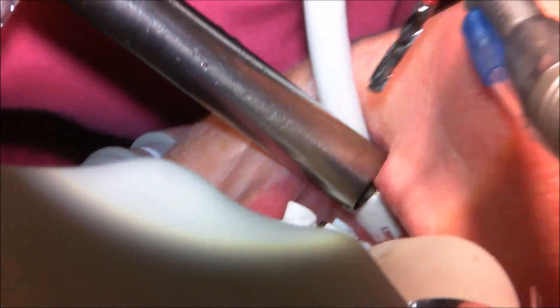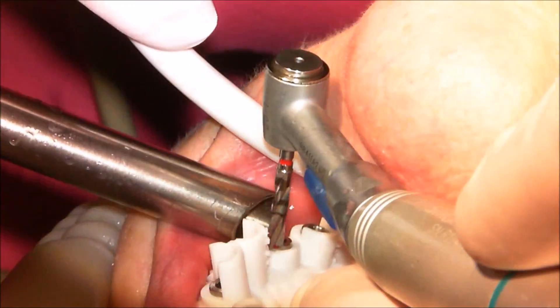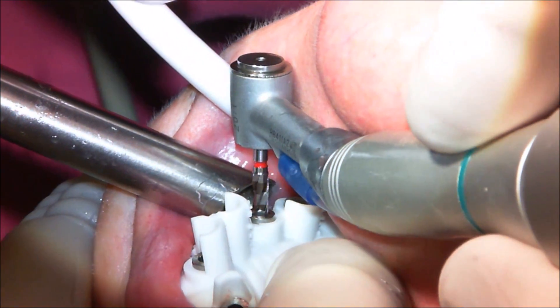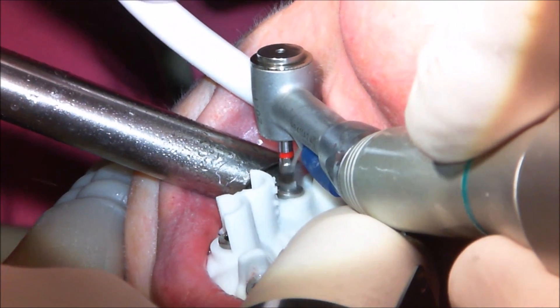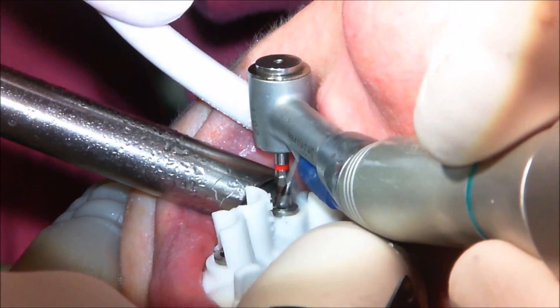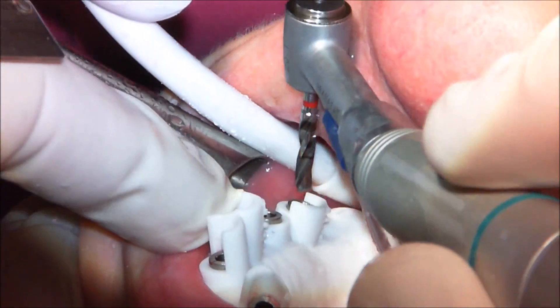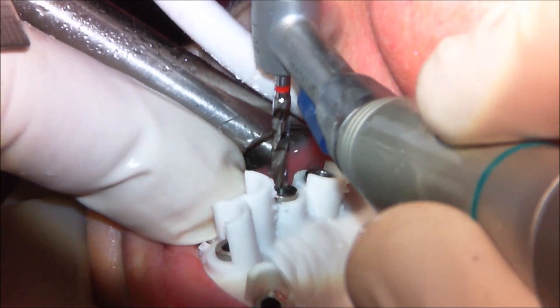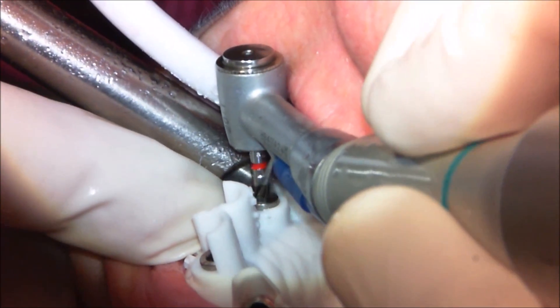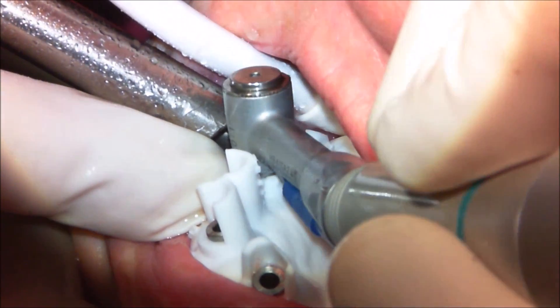You might note that I've changed to the short drill for this one — the stop is also shorter. That's because this is going to be a 10 millimeter implant instead of 11.5 like the other three. Same procedure: sink the drill until it bottoms out on the guide tube. The drill used on all four anterior sites is the drill for a 3.0 millimeter implant.